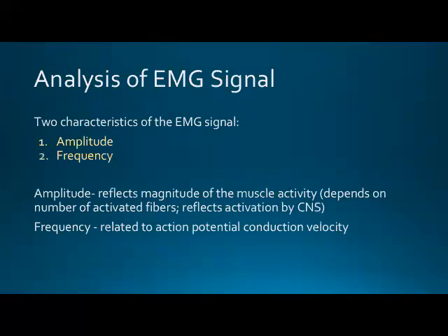So you guys don't need to worry about that. In general we're going to break apart our EMG signal into two primary components. It's amplitude and it's frequency. So how large are those waveforms, and then how frequently we're getting signals being picked up from the action potentials.